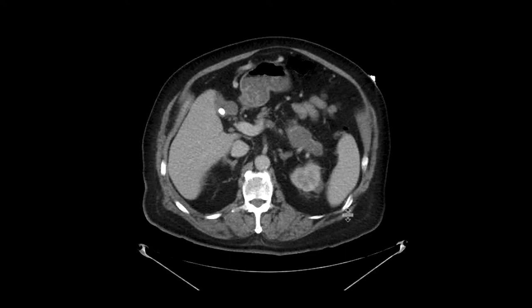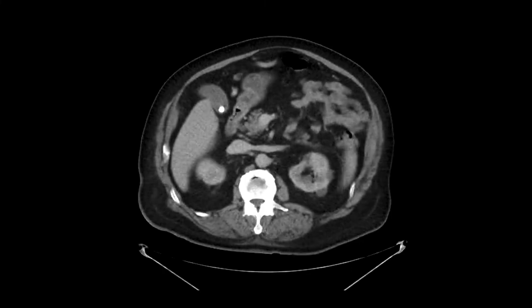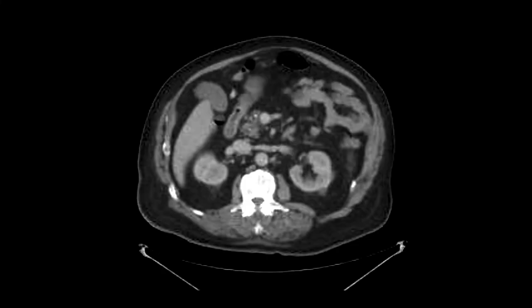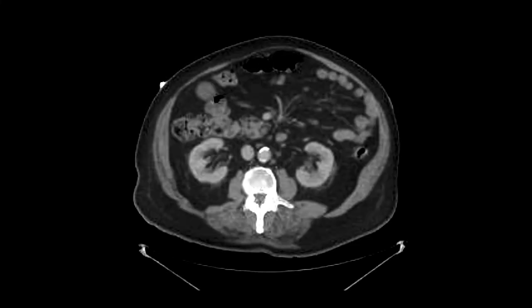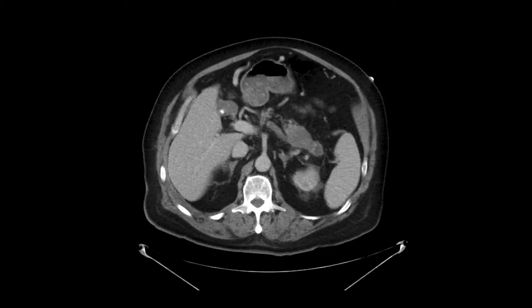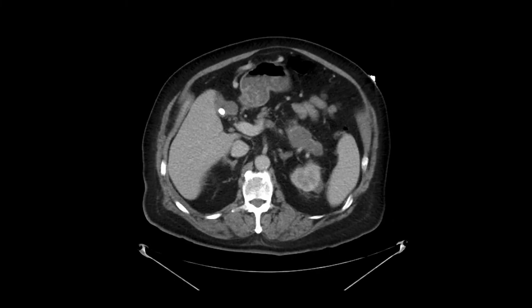As we scroll through, you can see immediately that there's an abnormality involved in the pancreas. It's really a focal mass at the tail of the pancreas that looks solid. Upstream from it, you can see that the duct is slightly dilated, and there's some atrophy of the surrounding parenchyma. As we scroll through the remainder of the pancreas, it appears relatively unremarkable, but certainly in the tail, there's a very focal mass.